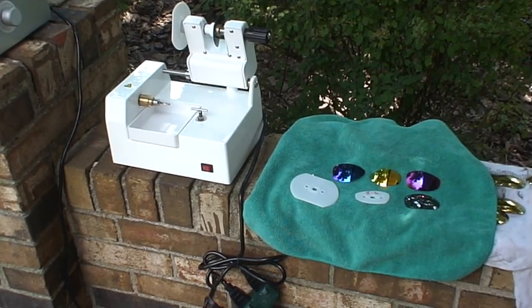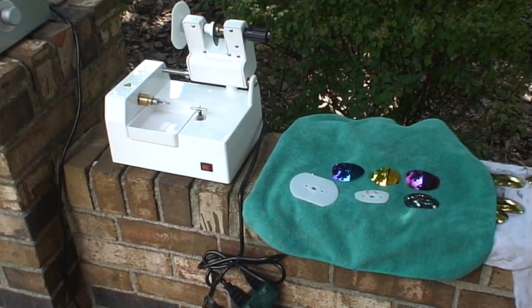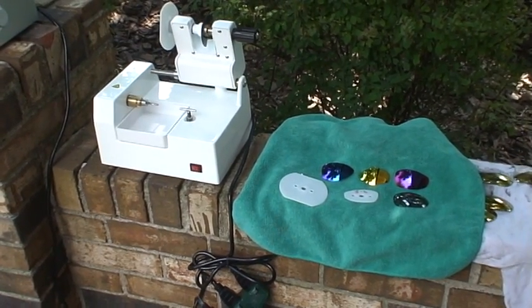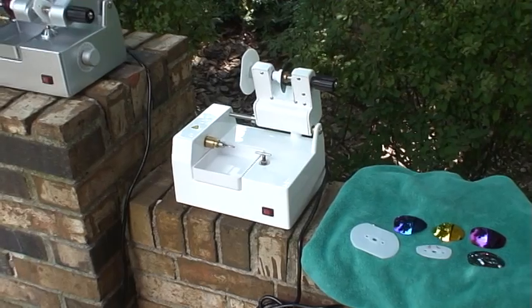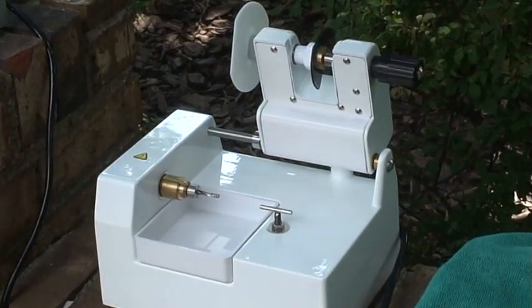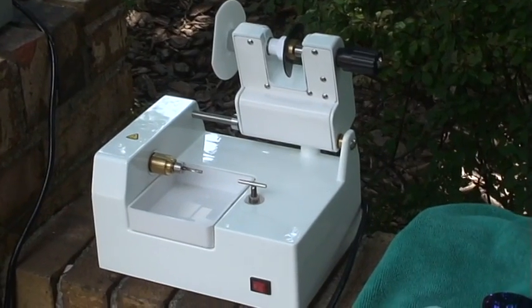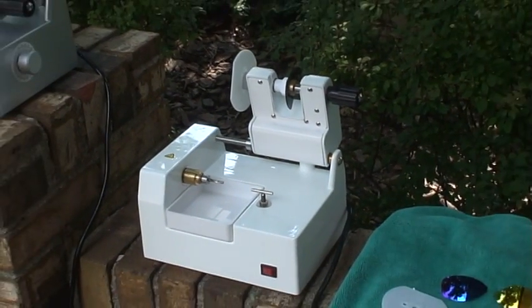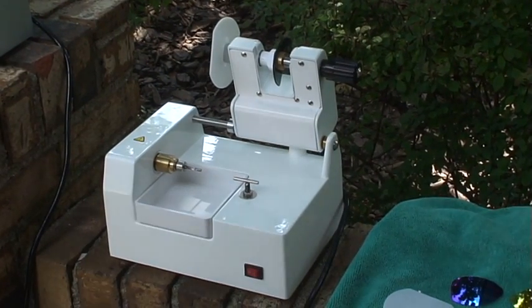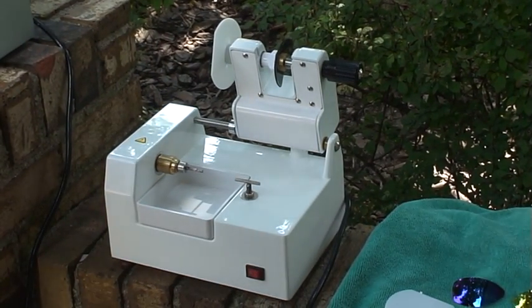Alright, so here's a quick and dirty video of cutting lenses using a pattern maker and a lens cutter. First you use the pattern maker and you put your donor lens, or rather your original lens, in the cutter, and then you put a blank in the other end of the cutter and use the pattern maker to make a pattern. In this case it's a Juliet, I think it's a right lens.